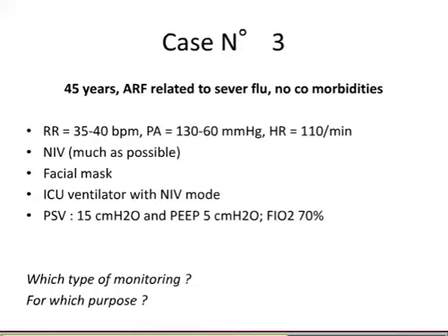So for those of you, arterial blood gases are determinant in order to decide. Of course. Okay. So for those of you who want to try NIV, how would you monitor? You said PO2, so arterial blood gases. Any other suggestions?